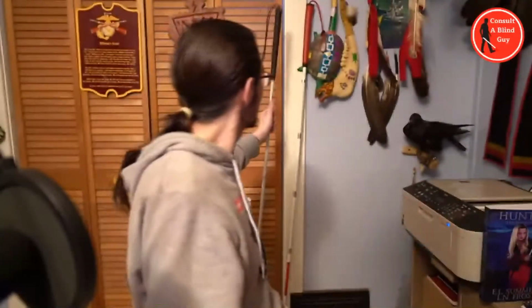And this to me is much better than having something that is stationary and does not rotate, for the simple fact that when it starts to wear down and creates that little cone type edge, it gives you more direct contact to the ground that you're walking on. It still rotates just fine across the axis as you sweep back and forth, and it still gives you that audible feedback, which is perfect. That's why I prefer using the marshmallow tip that rotates rather than one that is stationary.